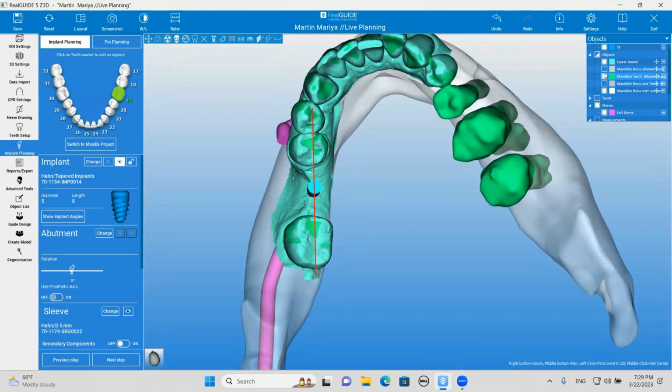Let me tell you where we used to run into problems. And this is just because we didn't know any better 20, 25 years ago. We would put an implant in like this and just put particulate bone on the facial. We didn't realize that you really have to prep the site. So you have to make sure there's no soft tissue attachments there. Secondly, you want to decorticate it a little bit to get angiogenesis, more blood supply. And that also will give you a little bit of mechanical retention for that bone.